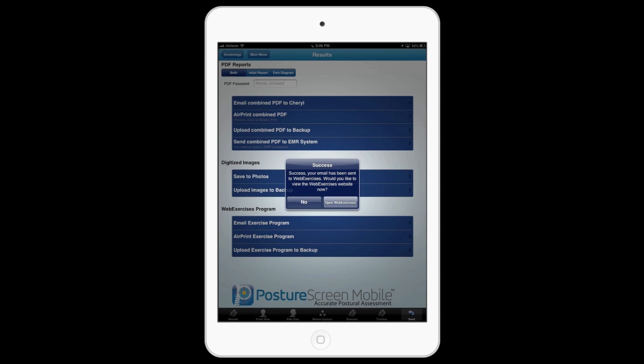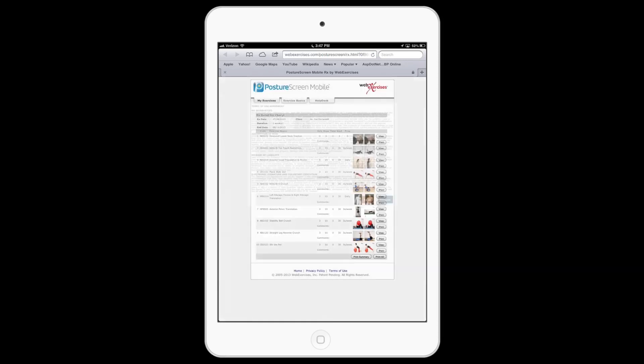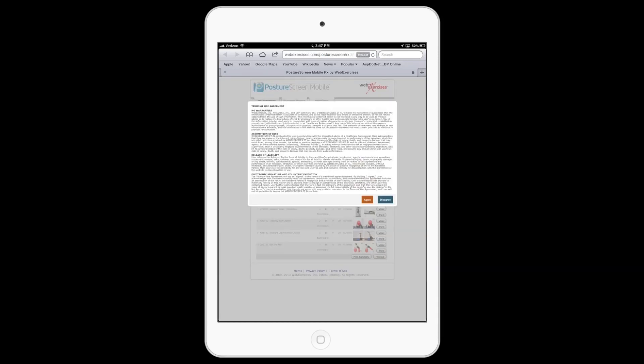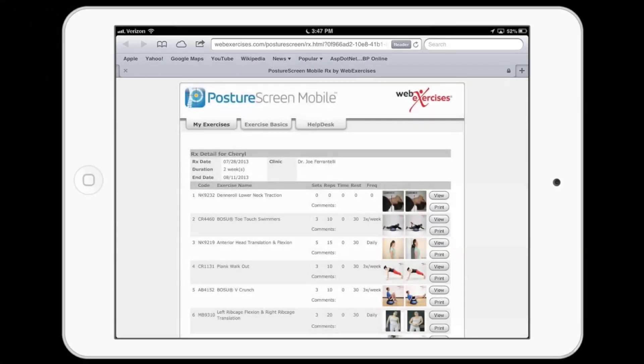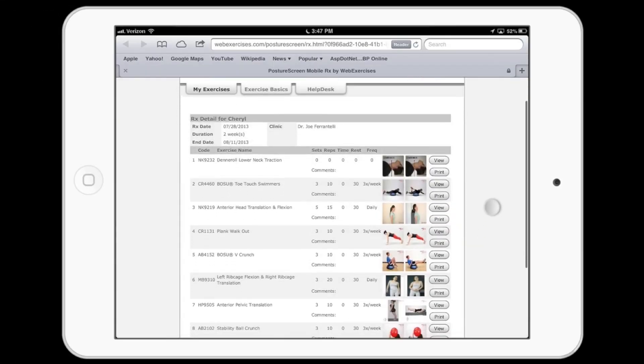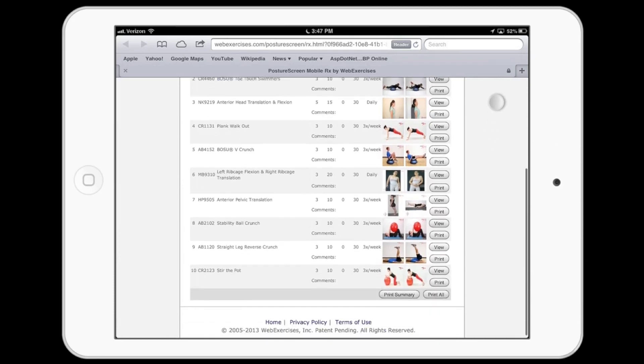To see what it looks like, let's go ahead and hit 'Open Web Exercise'. Now your patient also got a copy of it, and we're calling up the exercise protocol just so you can see what the patient is going to get. We'll press Agree, and these are the exercise protocols.